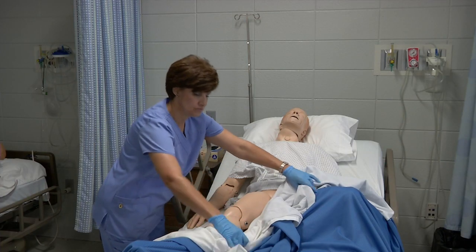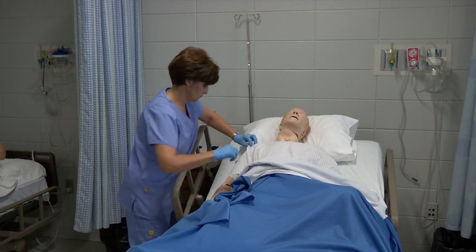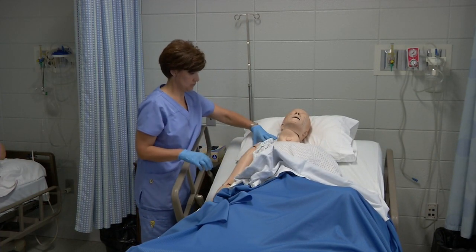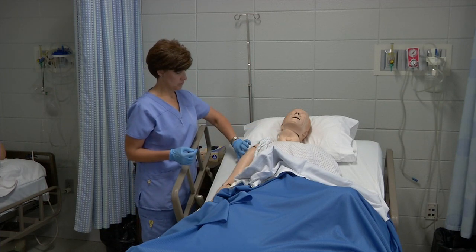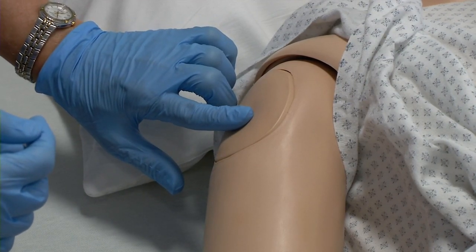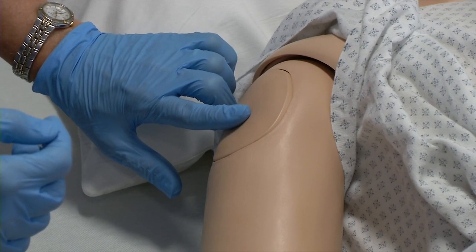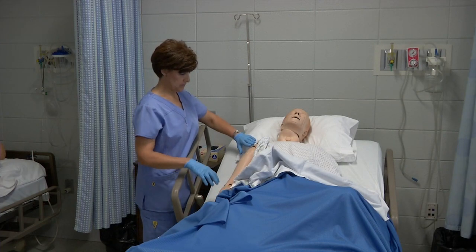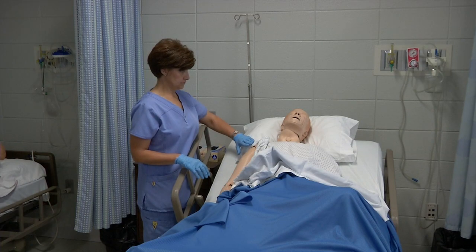The next one will be the deltoid. The deltoid, you will use this site for medication volumes that are 2 milliliters or less, or for most vaccine sites. You're going to have the patient relax their arm at the side and flex the elbow. The patient may sit, stand, or lie down.